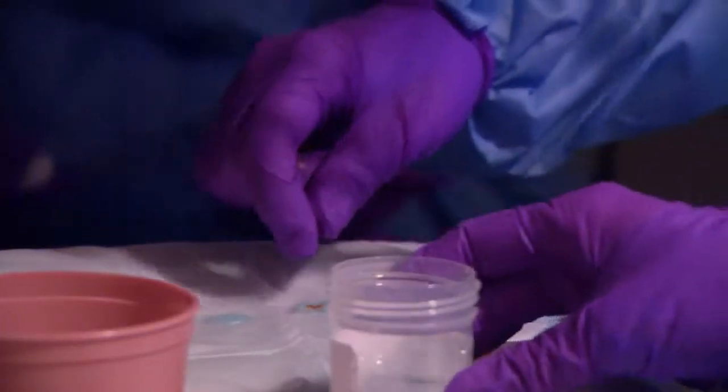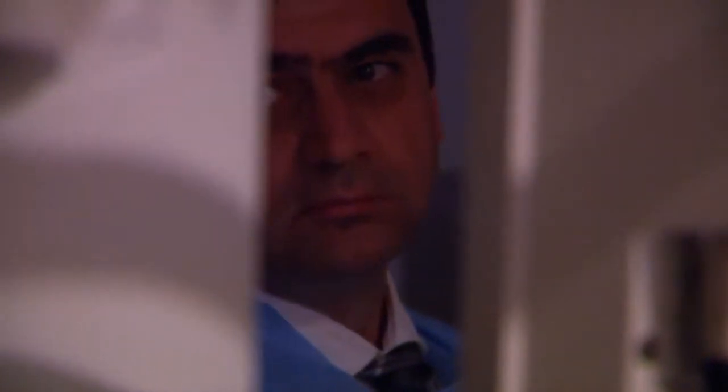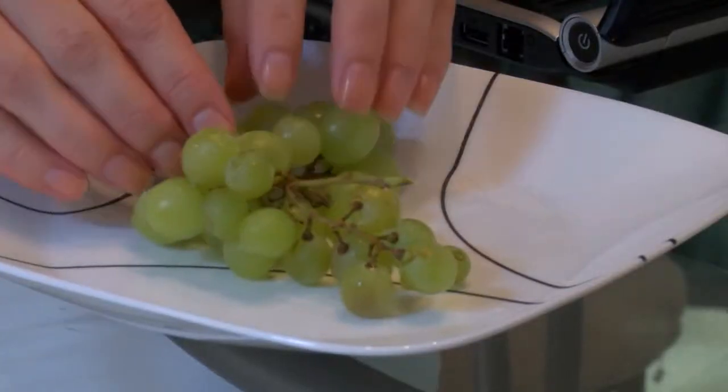In the past, doctors might take dozens of biopsies at a time just to be sure. If you have this laser probe, you can actually touch the lining and you can see whether something looks normal or abnormal. And the number of points you can touch it can be numbered in the hundreds. That allows him to spot problems more precisely and take fewer but more accurate biopsies. An approach IBD patients like Sue will tell you is much easier to swallow.